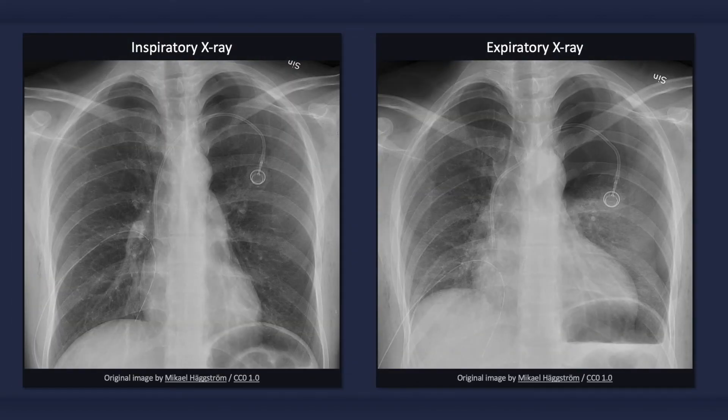The trachea is central, as mediastinal shift does not occur. Normally, the chest x-ray is performed with the patient on inspiration. Can you detect the pneumothorax on the inspiratory x-ray? Now how about on the expiratory x-ray? Occasionally, the air between the lung and the pleural space is easier to detect with an expiratory image.